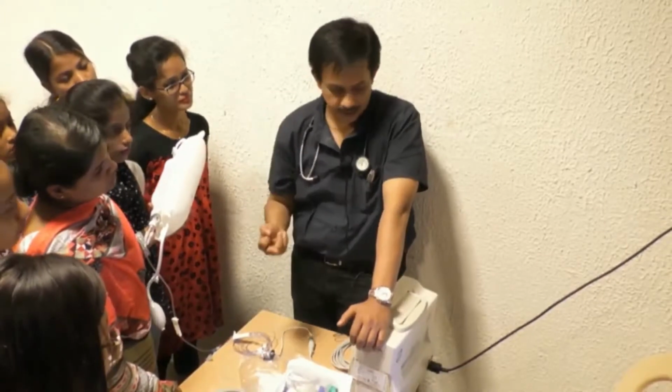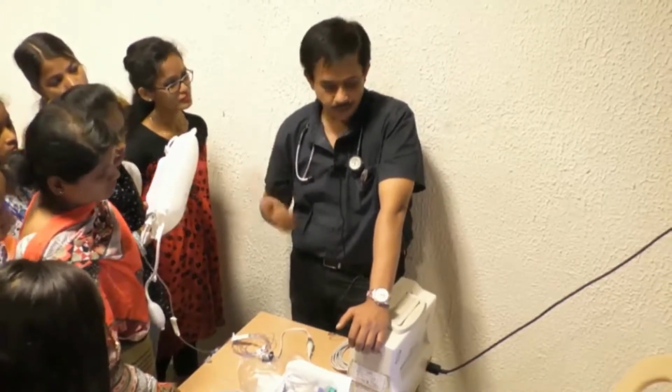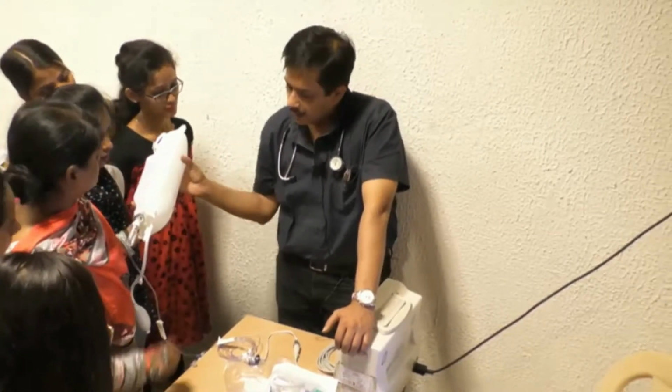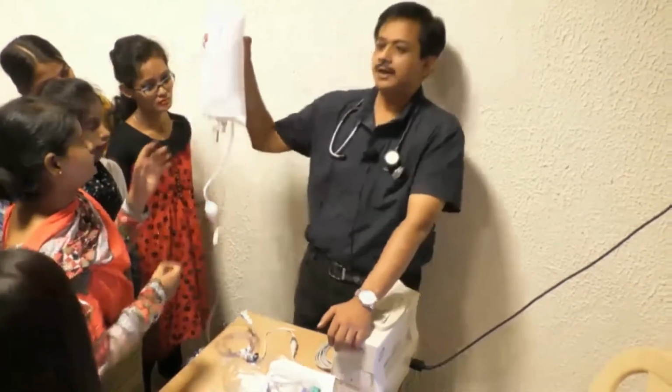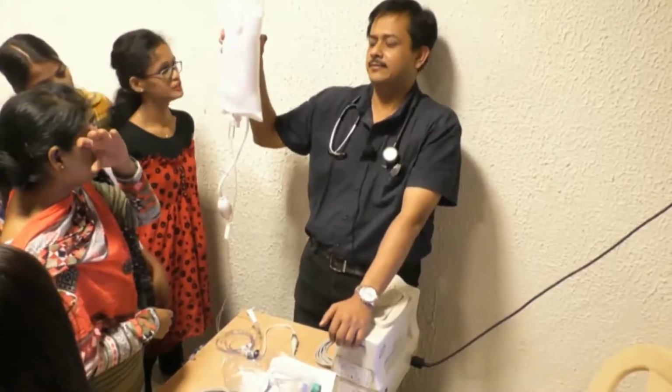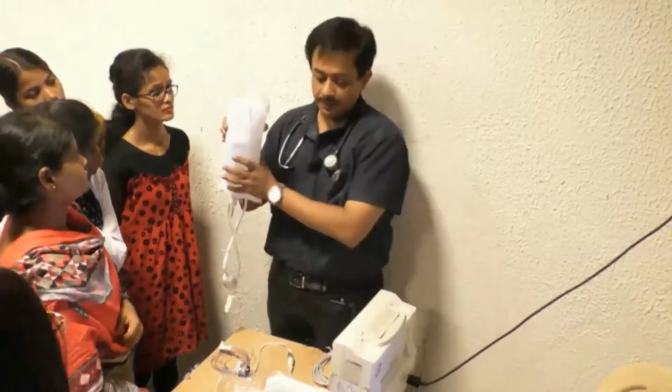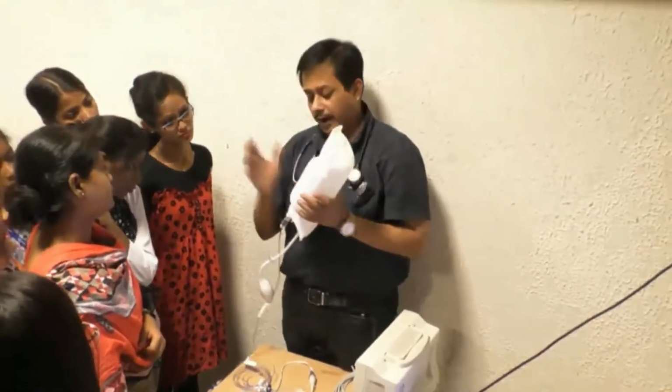So we have done leveling, zeroing and the flush test. After this, how much pressure needs to remain at this? Yes, more than 200, so usually we keep it at 300. What will happen? I mean, 300.